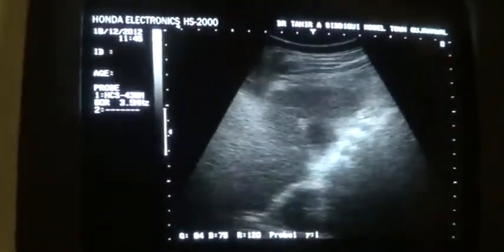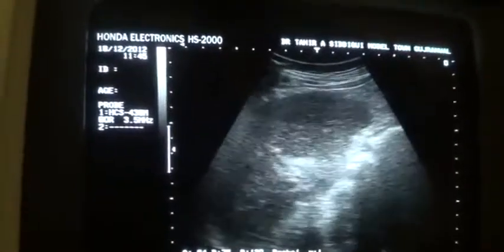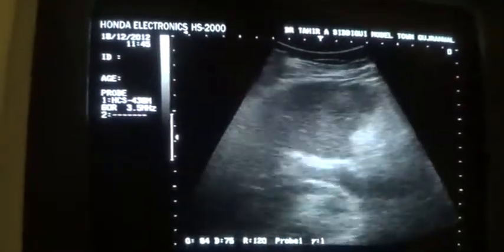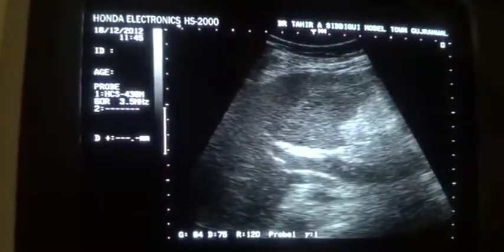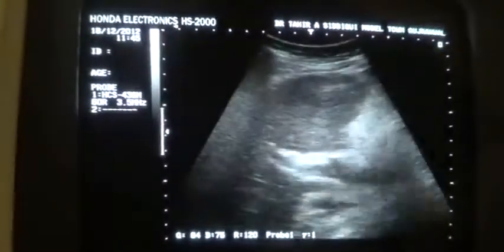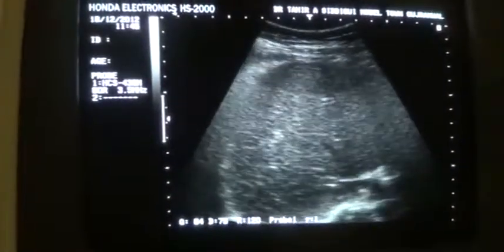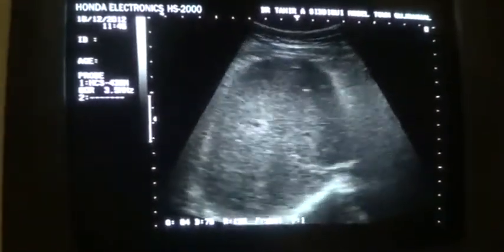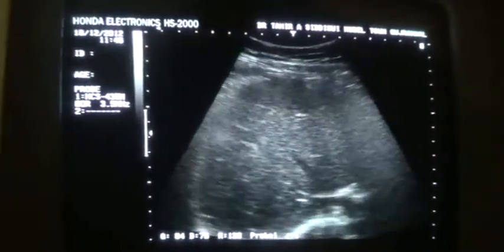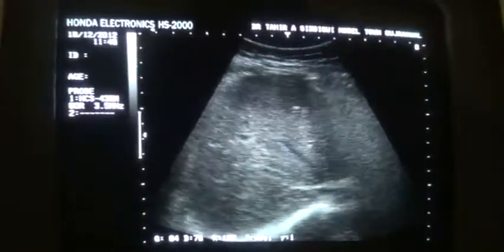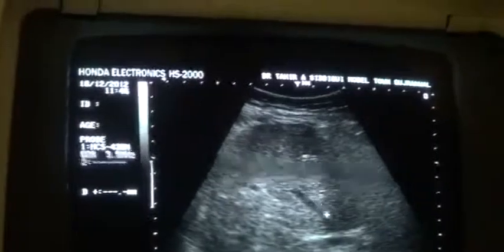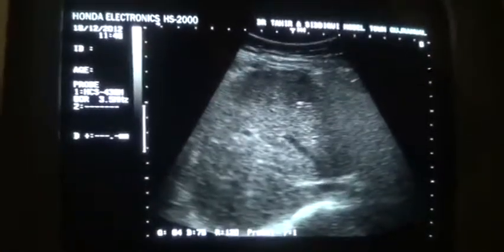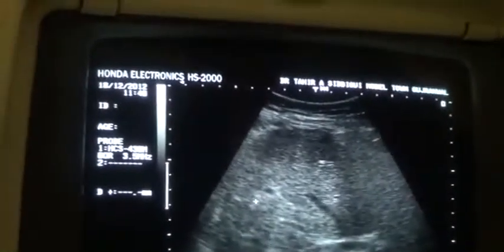In this particular case of cirrhosis, the liver is seen below costal margin. Its echogenicity is raised. This is the portal vein, and you will see that the hepatic veins show a significant degree of blurriness of the margins. This is the middle hepatic vein — note the degree of blurriness and the coarseness.